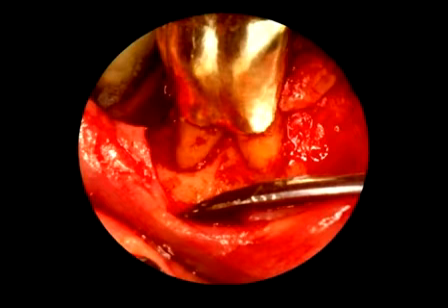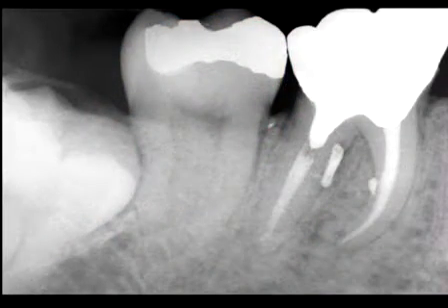A simple surgical procedure was again performed, and you can see the inevitability of the bone to rise to the surface after careful cleaning, shaping, and packing. A postoperative film demonstrates complete osseous repair. Evidence-based endodontics provides compelling evidence of the completeness of the pack.